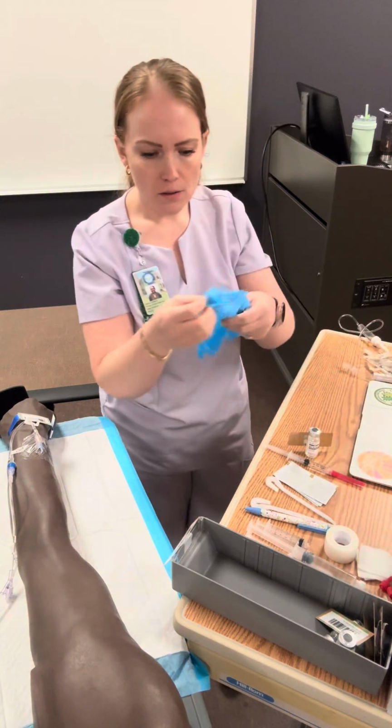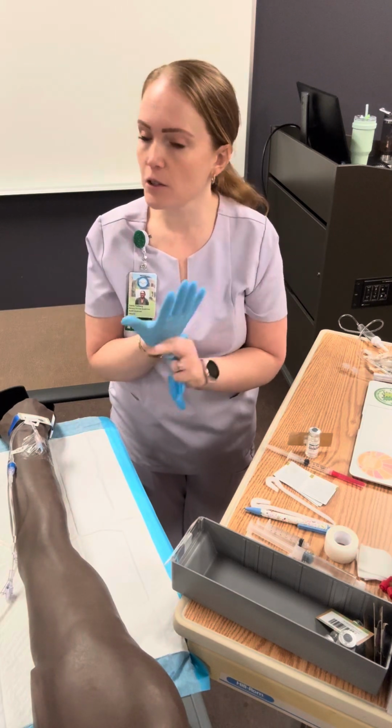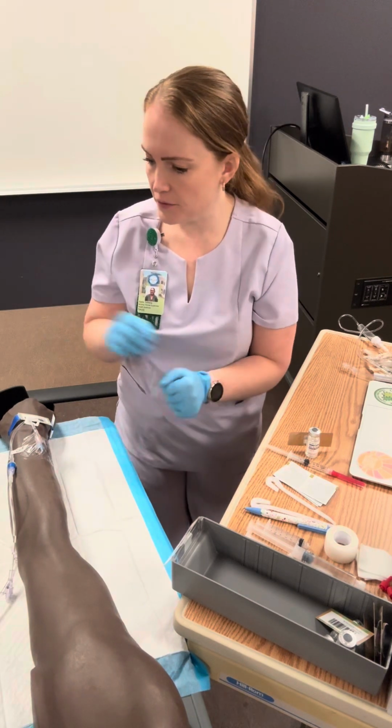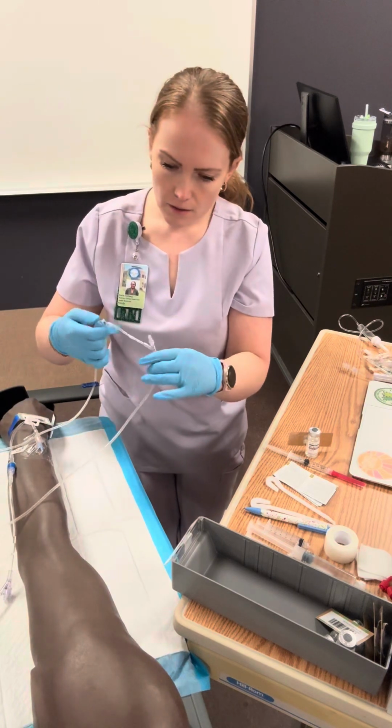And while I'm looking to make sure everything has been flowing well with your regular primary fluids, looks great, I'm going to clamp those off. Okay, so that is clamped.